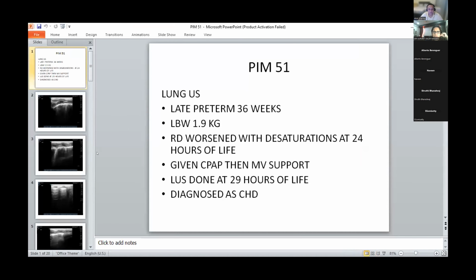But in the subcostal, we had a small VSD. The PDA was left to right otherwise. And there was an ASD, which was right to left. And there was a TR gradient, almost 40 to 45. So pure right to left at the atrial level should always raise the possibility of a PAPVC or a TAPVC, because usually even with PPHN, you should have a bidirectional shunt, maybe right to left. Amazing. Well done. Thank you so much.